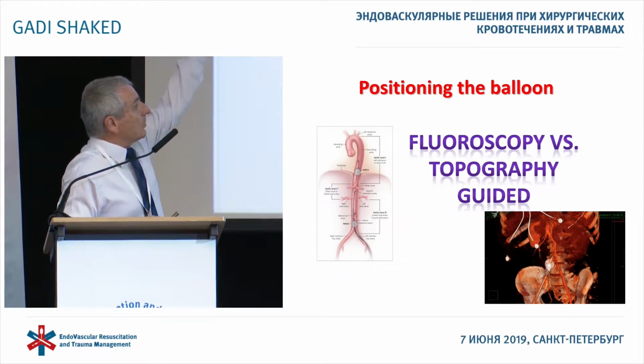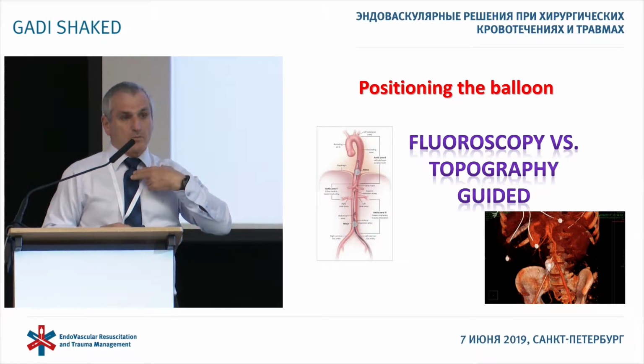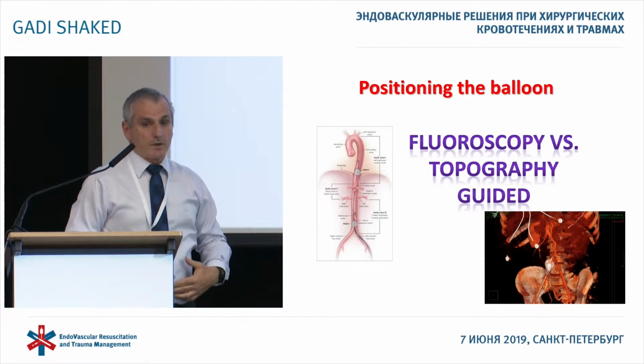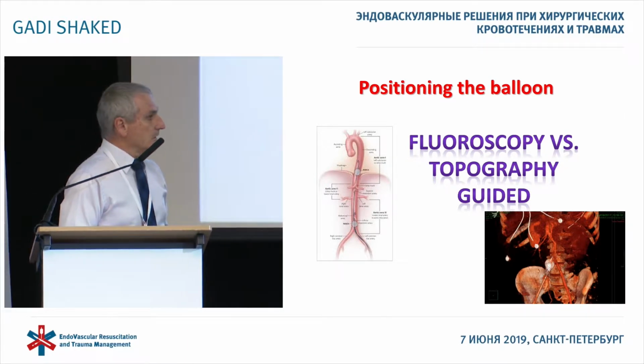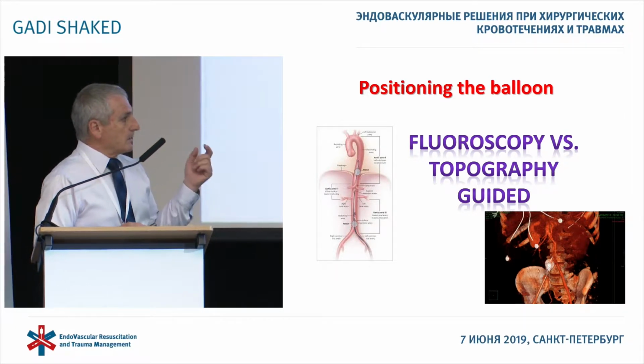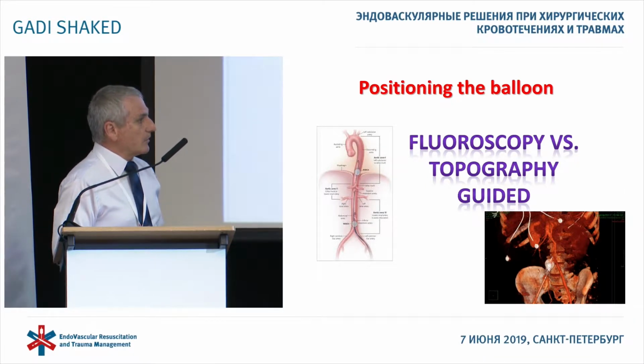If we are talking about zone 1, we go according to the manubrium. If it's zone 3, just a little bit above the umbilicus. For example, in our second case, we put it exactly at the level of the umbilicus.